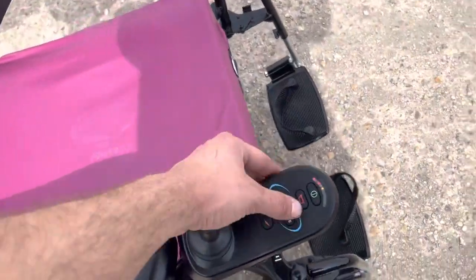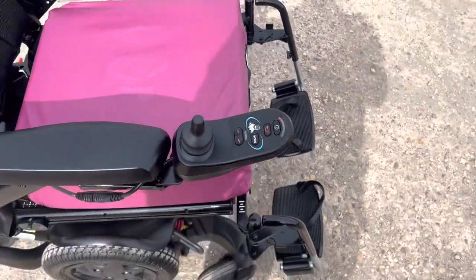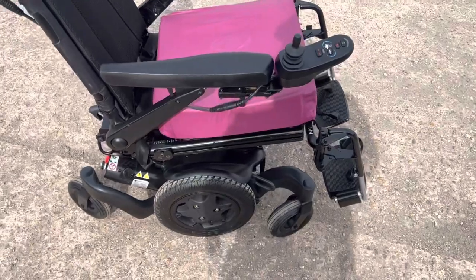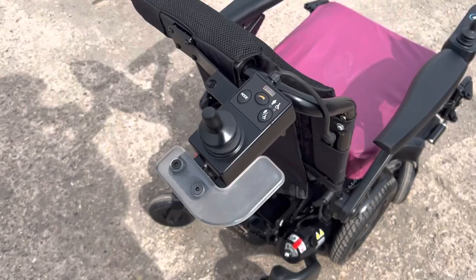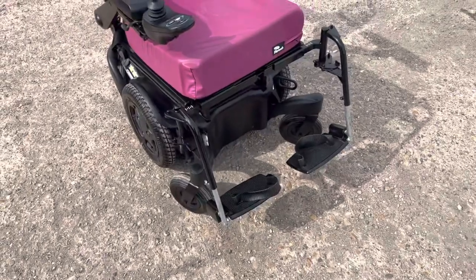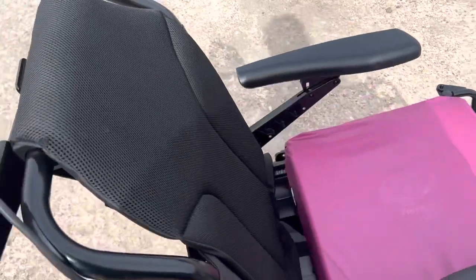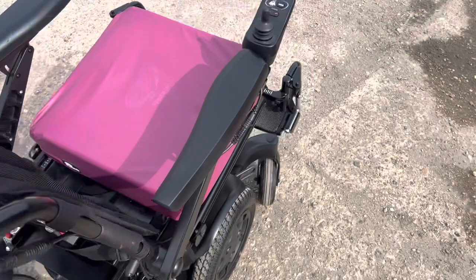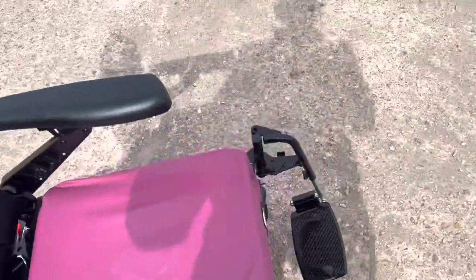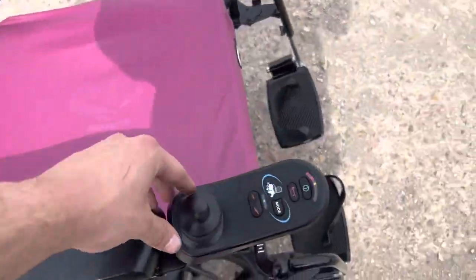It has different modes. This is the attendant control model — there's no recline, but it's a really clean 2021 chair. Six to eight thousand pounds from new. If you want to buy it online we offer free UK delivery anywhere. We usually say five to seven days, though it may be longer for further locations, but we do deliver nationwide. It's just a very clean chair.